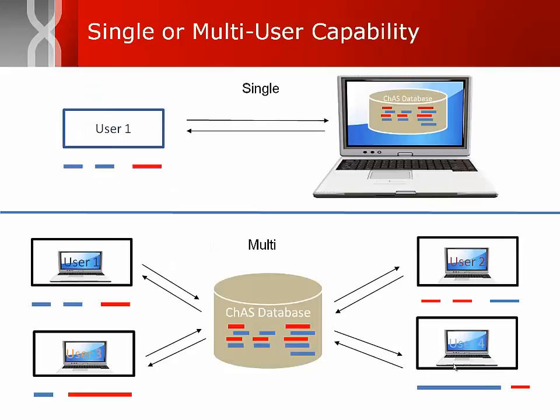There are a couple of different options on how to set this database up. The first would be as a single user. Here I'm user 1, and I have a ChAS database loaded onto my laptop, and I'm the only one querying it and adding data to it.